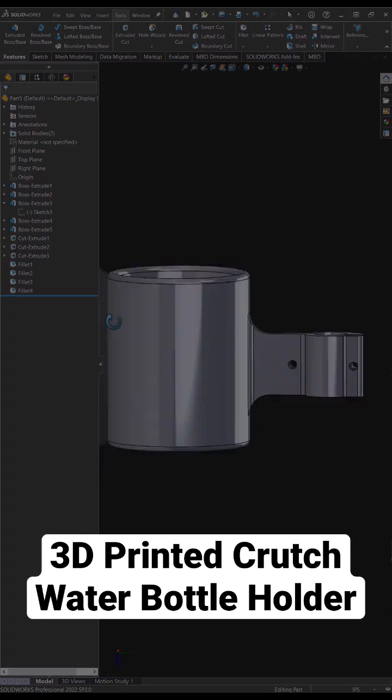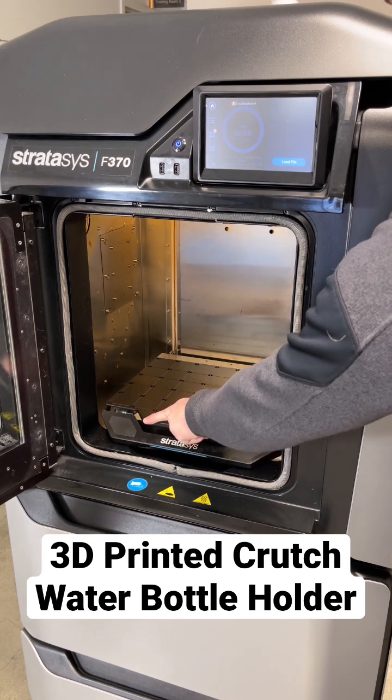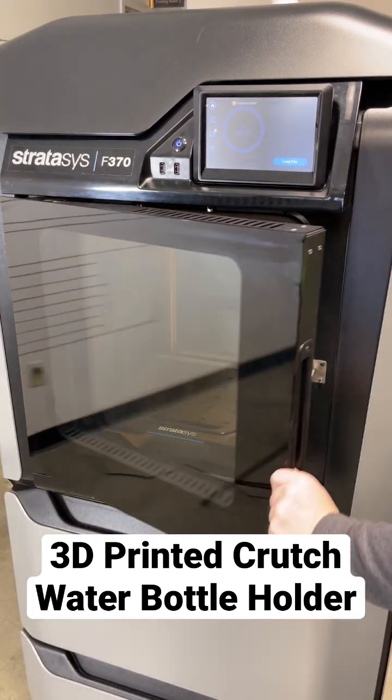I'm going to be printing this on a Stratasys F370 using ASA plastic. Here you can see me loading the build tray into the printer, and then once the door is closed we can start the print.